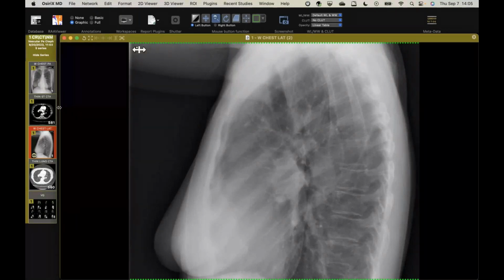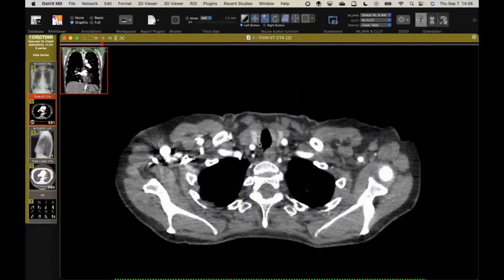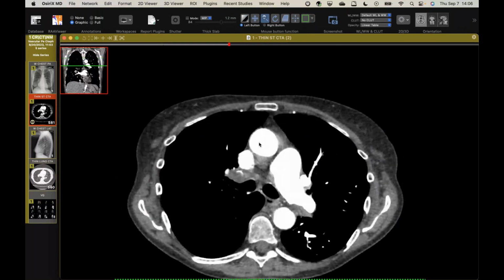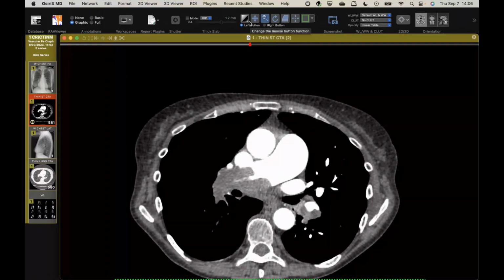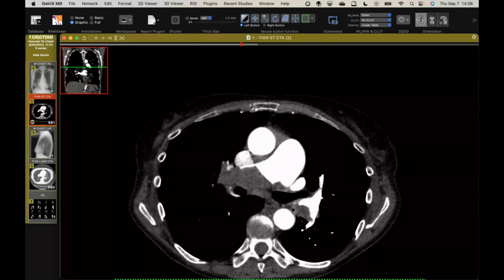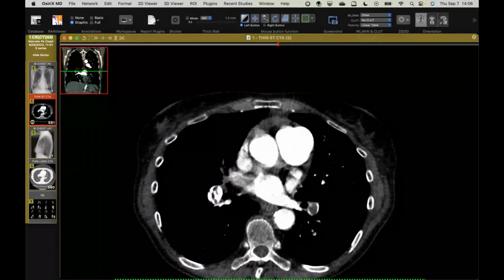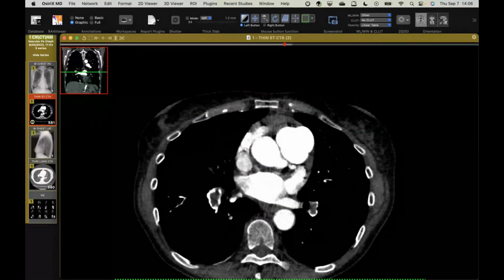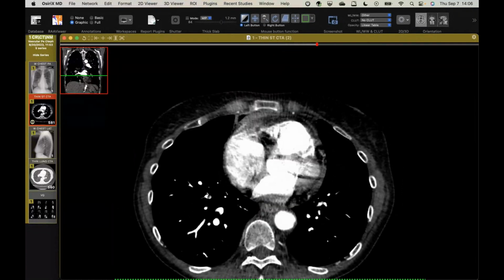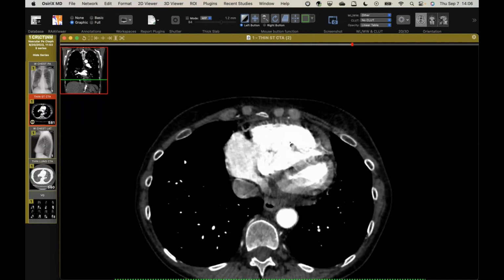They were worried about acute PE at the time, so she got a CT scan, and what we see is clot in the pulmonary arteries, but you'll notice that it's not your typical acute PE. It's along the walls, and there's irregularity to it, and there's some webs here. So I think most of this is not acute, but rather chronic clot in her lungs. Her RV is dilated a little bit as well.